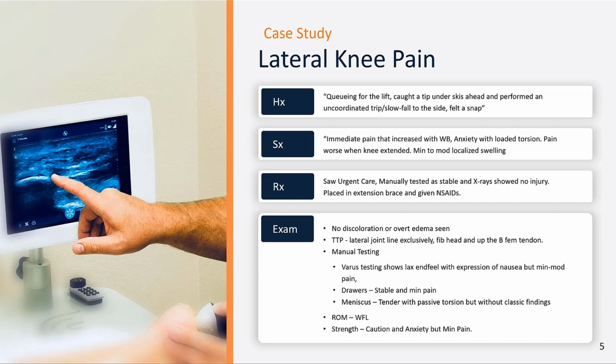On my examination, I did not see any discoloration, and with palpation to the knee, I didn't find any edema or any swelling, but I did notice that there was quite a bit of tenderness near the fibular head and also into the lateral collateral ligament, and that entire complex was exquisitely tender to pressure.